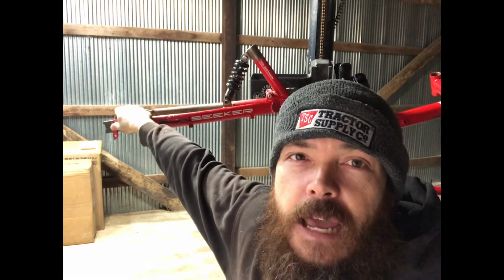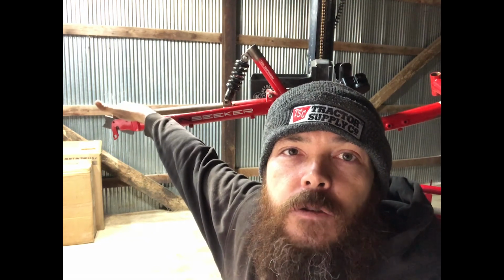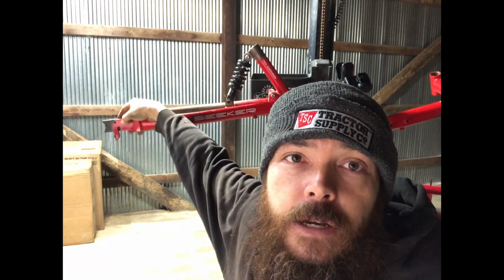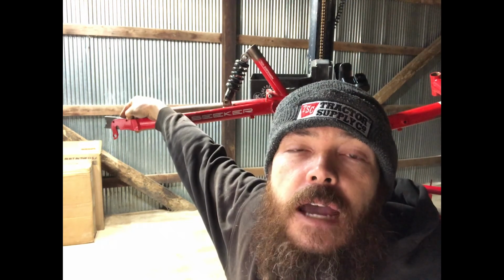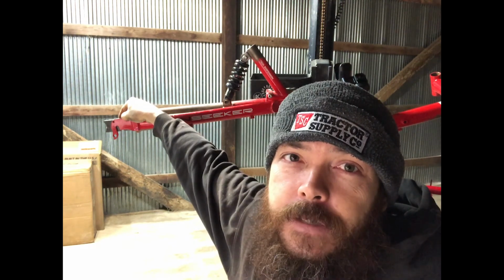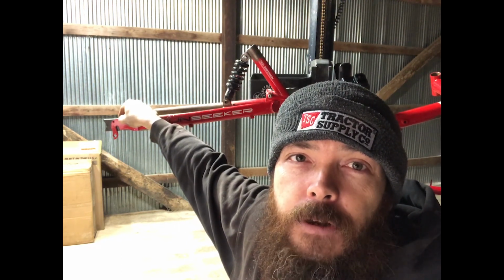I guess theoretically you could just bolt it on there, but with the one bolt, it's going to have a tendency to tip because there's no two places to lock it in, so it's just going to swivel on that one bolt. I guess you could drill another hole right here and then drill another hole in the plate and then have two points of contact and lock that in. But for my purposes, I'm actually going to weld this on here because I don't want this coming loose, and this should be part of the structure of the rear swing arm. It is part of the rear cage.